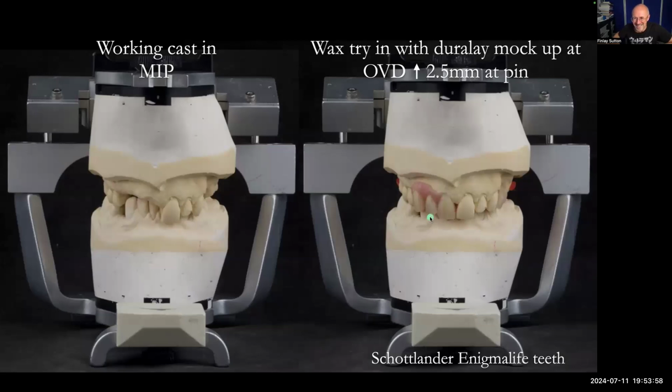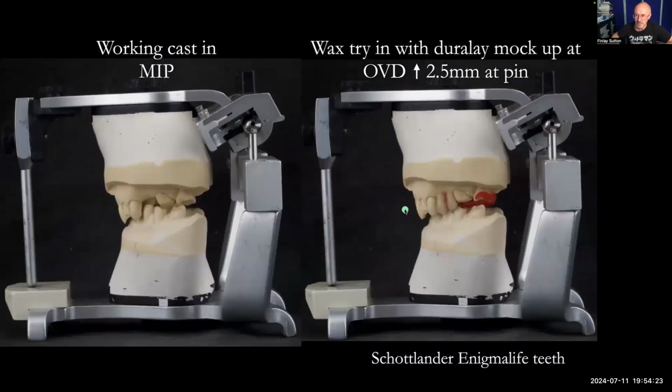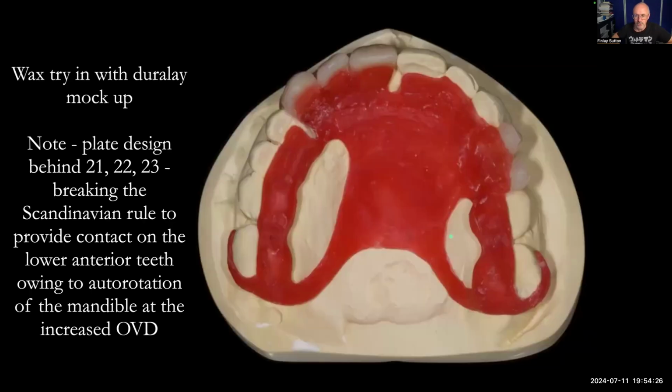Importantly, from an aesthetic perspective, I think this is super important when I'm restoring these cases, is when I've got a root surface there, because we've still got the canine, we've got the incisal root, the incisor eminence just there. This is almost like a removable crown that just sits on the root. Looks way better because we've still got the gingivae there too. So this is the mock-up here. And this mock-up here is made of Duralay. It's pattern resin. Some of my colleagues are now doing that in printed. They're printing these to check them too.